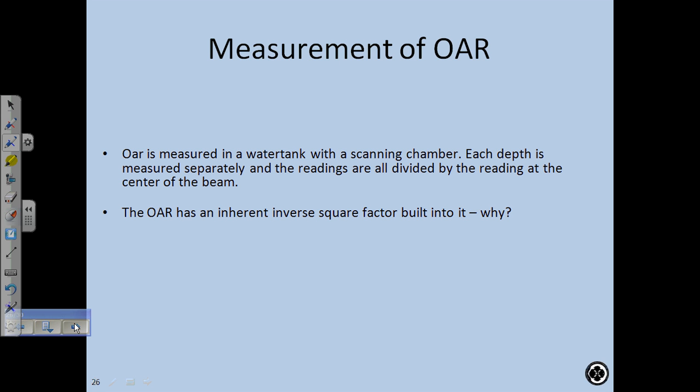Okay. And then there's a question here. OAR, so the tank looks like this. Here's the water surface. So we just scan the chamber across. Now, OARs are done at SAD. So the scan has to be done at SAD. So if we change the depth, we need to change the water surface to do this. Okay. OAR has an inherent inverse square factor built into it.